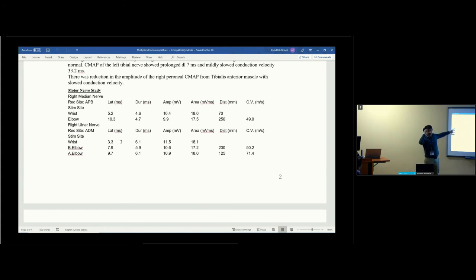So those are the patients where you want to make sure you're not sitting on a surgical case. If somebody's exuberantly losing axons, he needs surgery rather than pain control. Or if you do pain control, he may just linger on a bit more because the original compressive pathology is still there. But what if he does not have a lot of axonal loss or a lot of changes on EMG? In that case, you want to maximize what you can offer interventionally.